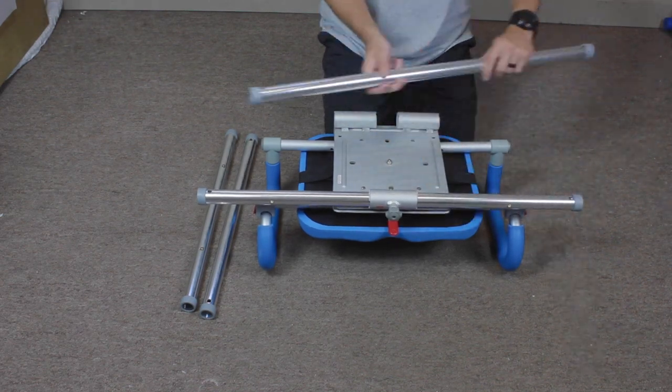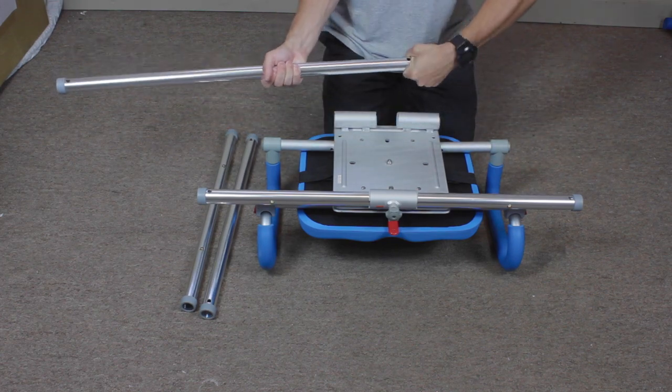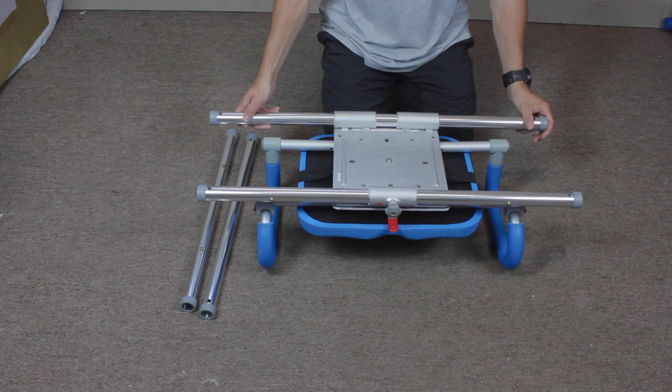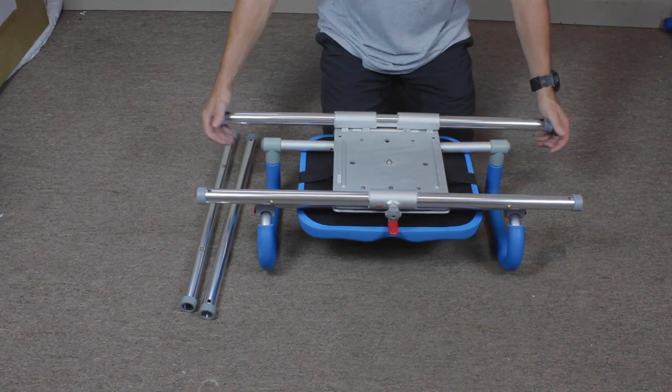Do the same for the rear rail. Replace the end cap and you are ready to assemble the rest of the chair.